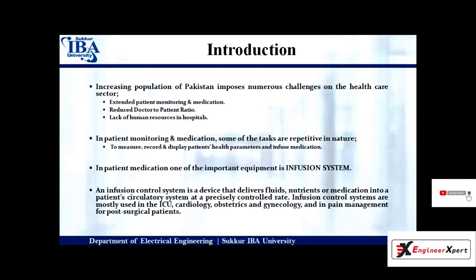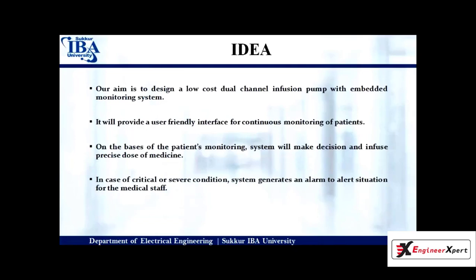So please next. Our aim is to design a low-cost dual infusion system with monitoring that will provide a user-friendly interface and continuous monitoring of a patient. On the basis of patient monitoring, the system will decide and infuse a precise rate of infusion to a patient. In case of severe condition, it will generate an alarm for the medical staff.